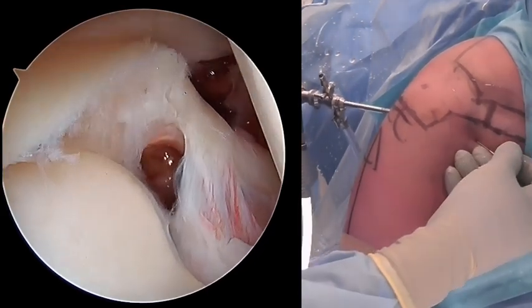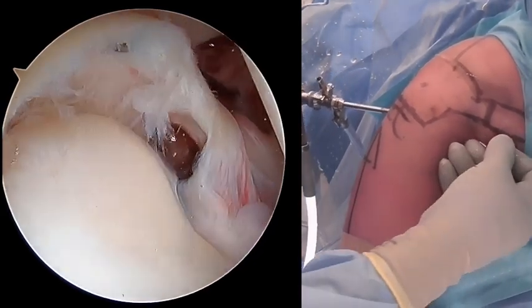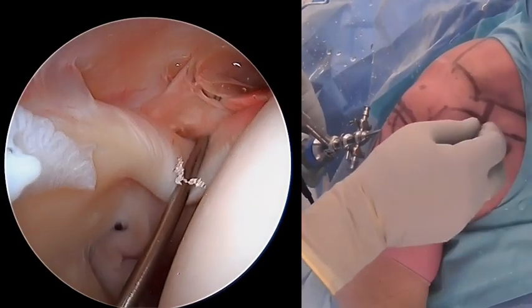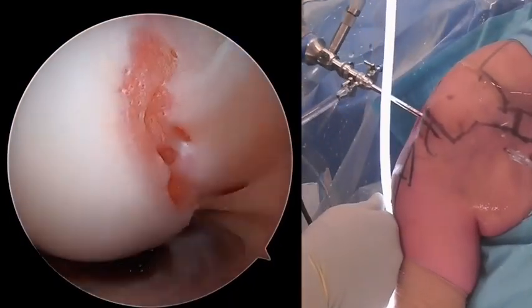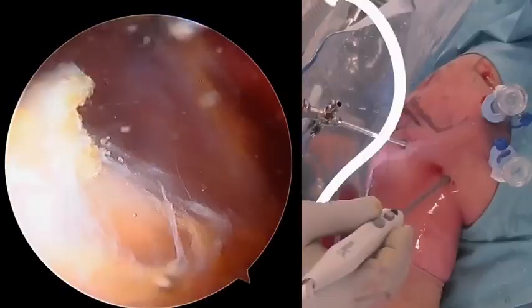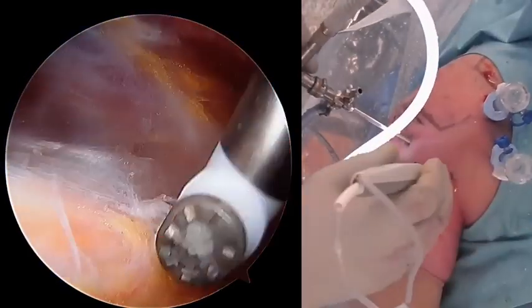Here you can see a superior labral tear extending underneath the biceps tendon as a SLAP tear. We complete the diagnostic arthroscopy and then move to the subacromial space, clear the bursa, and then shift the viewing port from posterior to the working port.